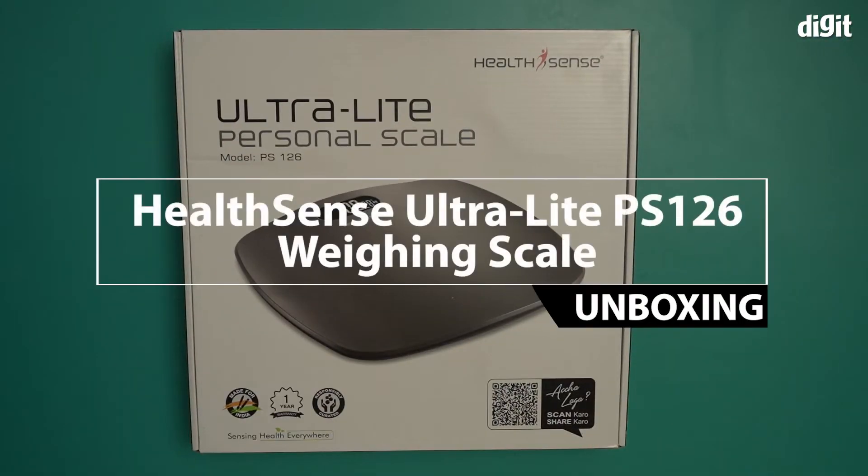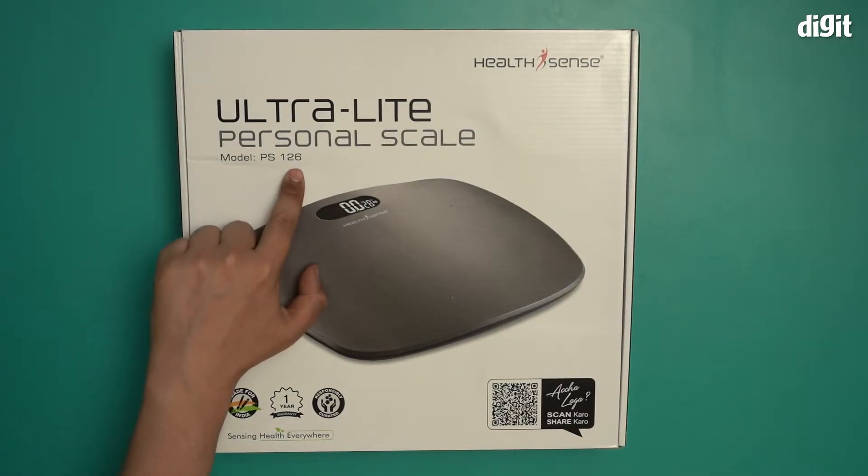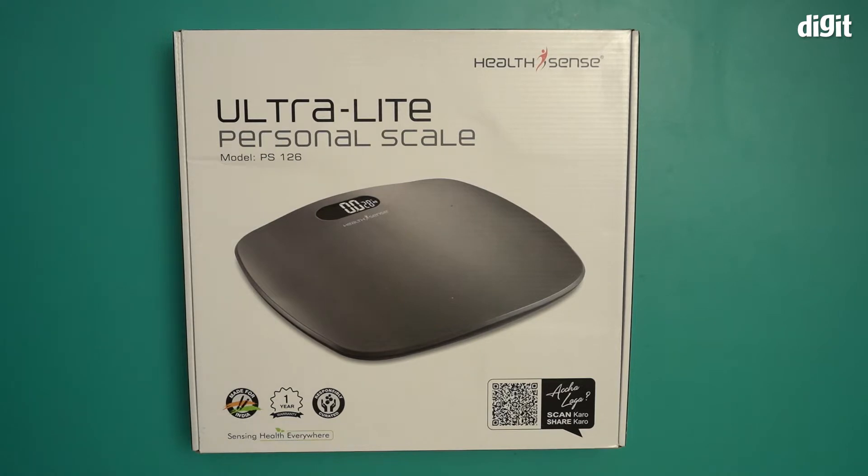Hello and welcome to Digit. In this video I'm going to be unboxing the HealthSense Ultralight Personal Scale. The model number is the PS126, which it says right here. It's made for India — not made in India, but made for India. It has one year warranty, and 'responsibly curated' is what it says right here. There's a QR code right over here which you can scan on the front.